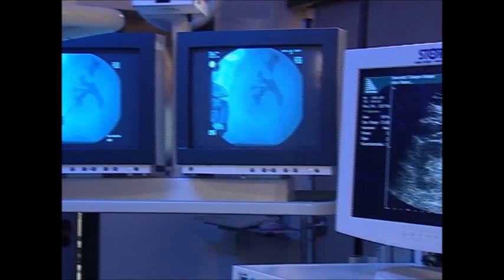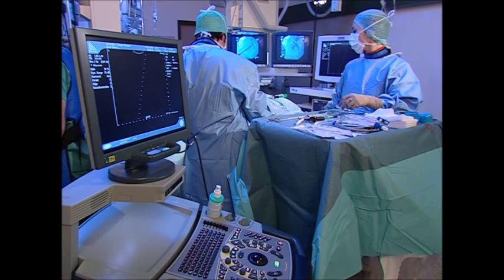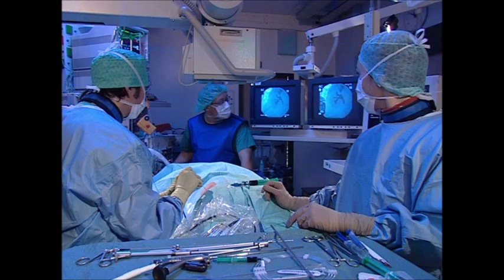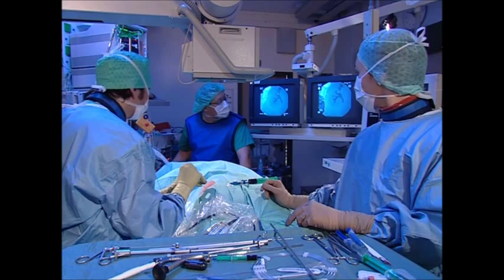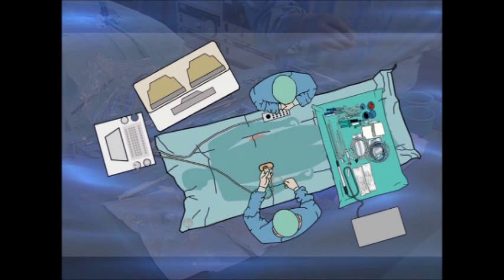Being connected to the endoscopy monitor, the ultrasound unit can be located some distance away from the surgical field. The team, consisting of the surgeon and scrub nurse, must be able to reach the surgical field comfortably. This permits effective and fatigue-free surgery, so that the duration of the operation can be optimized.